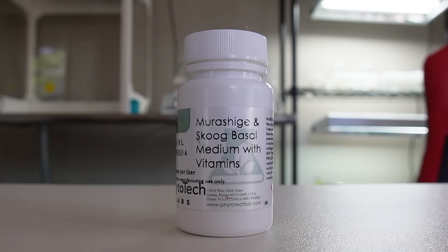The first ingredient is Murashige and Skoog, almost always abbreviated to MS or MS basal medium. MS provides a nutrient supply for the plant — it includes things like nitrogen, phosphorus, and potassium that all plants need, as well as vitamins and micronutrients to support the plant's growth in vitro. MS is the foundational ingredient for tissue culture.